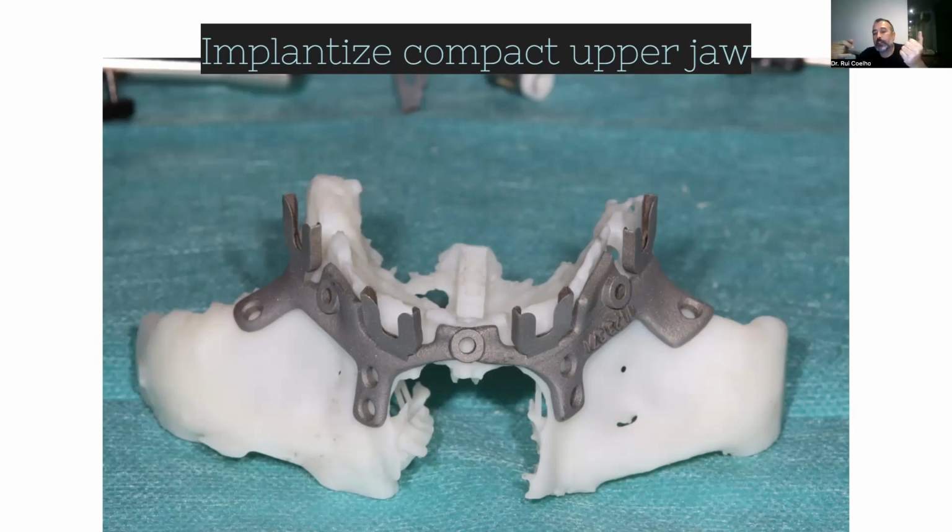Also, because of our connections, we always put it on a palatal approach, to be inside a bone envelope, and this bone envelope gives you attachment to the gum around the implant, and it greatly reduces the mobility of the tissue.